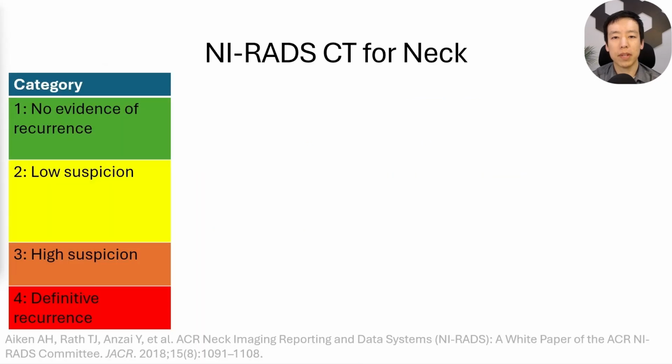First, some background. NI-RADS, or the Neck Imaging Reporting and Data System, is a standardized system used to assess imaging findings during surveillance of patients with treated head and neck cancer. That is, these patients have undergone definitive therapy and are asymptomatic, and so one is evaluating for disease recurrence.